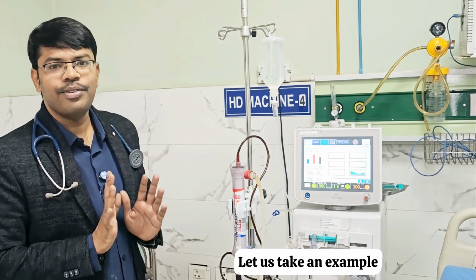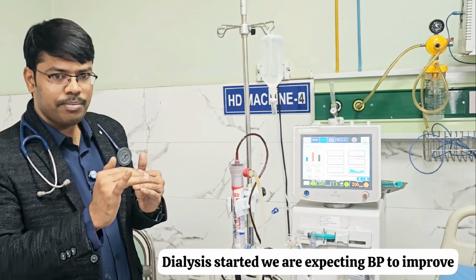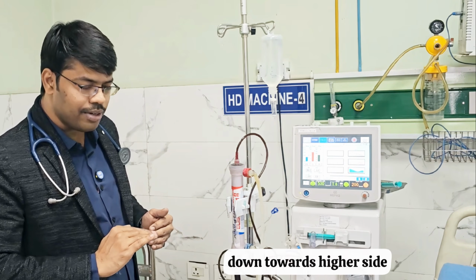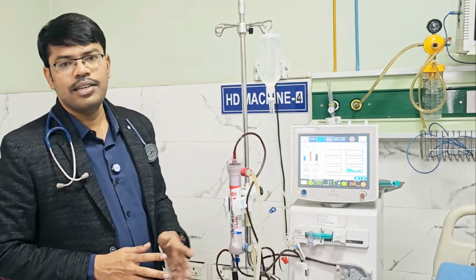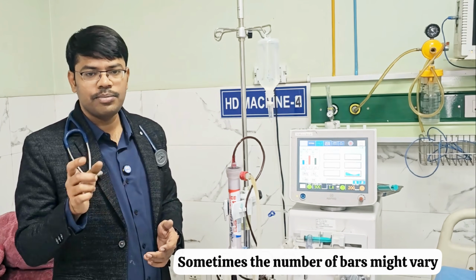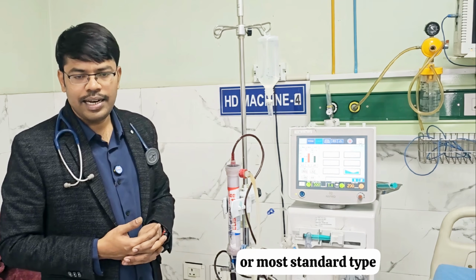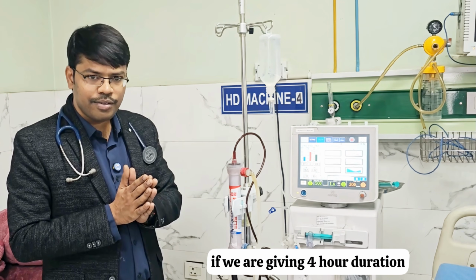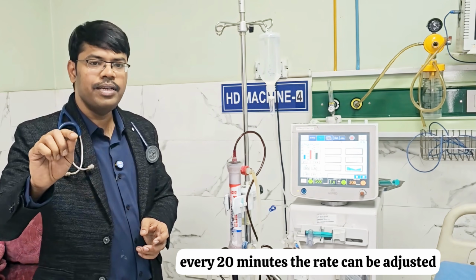Okay, let us take an example. Dialysis started, we are expecting BP to improve. During that time, we can select a graph going down towards higher side. There will be 12 bars. 12 bars will be there pertaining to this machine. Sometimes the number of bars might vary. Pertaining to this machine or most standard type, there will be 12 bars. Basically per hour, if we are giving 4-hour duration, every 20 minutes the rate can be adjusted.